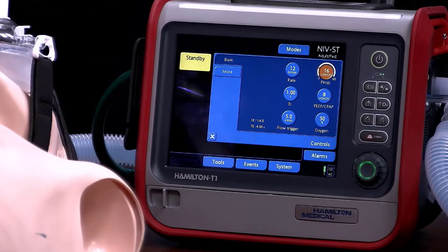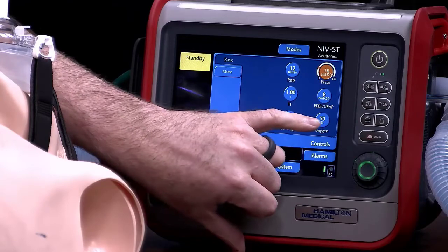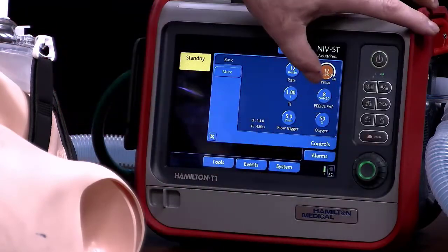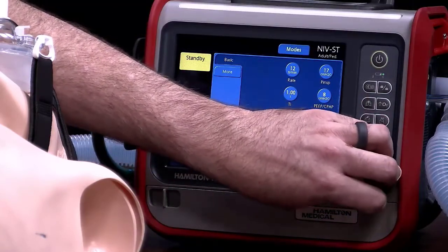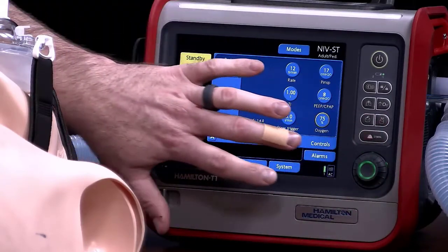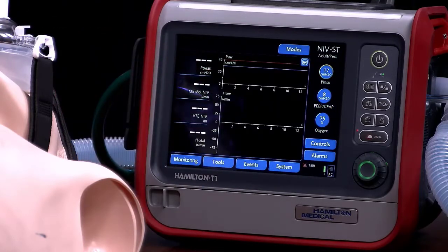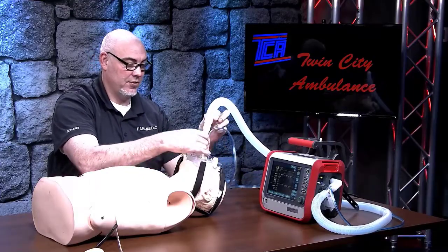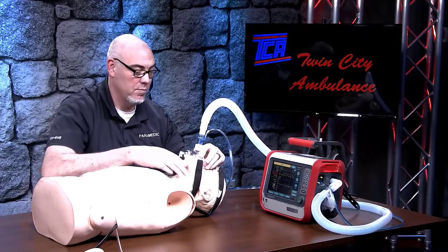Once we have these all set, we can go ahead and set our FiO2. We're going to put the patient on 75% FiO2. Click off of that and we're good to go. When we leave this control area, we're now ready to go. We can start ventilation and that's going to attempt to ventilate the patient. We'll plug this into the mask and it's going to try to establish a seal and get the patient to start breathing.